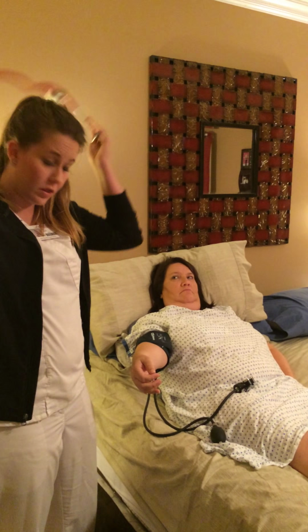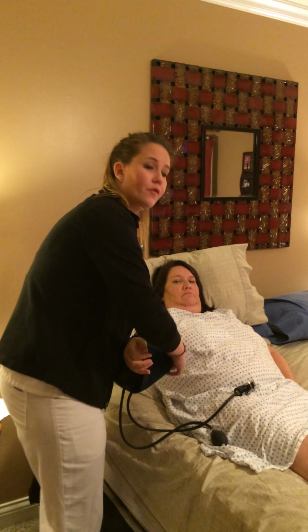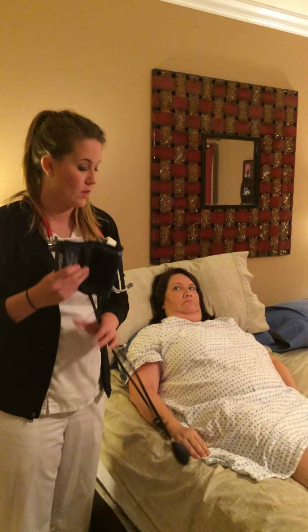I got a reading of 130/70. We know from the patient's health history that she does have a history of stage 1 hypertension, and she takes medication for that at this time.